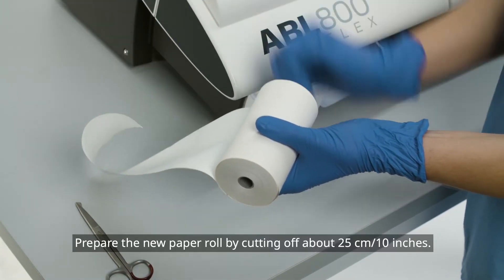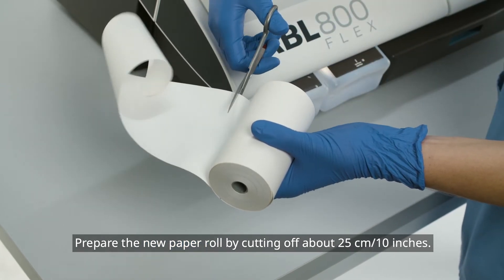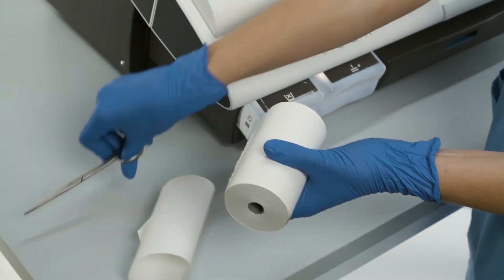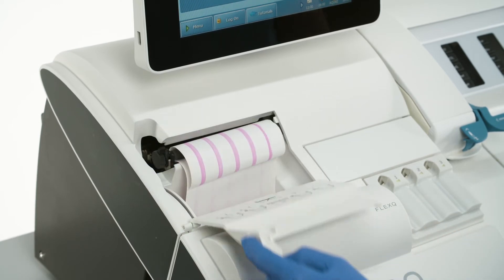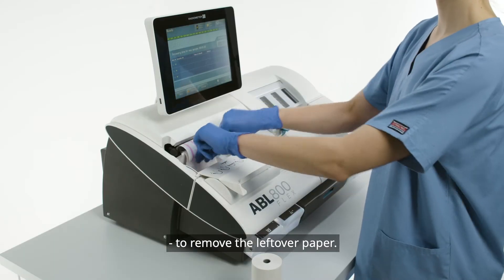Prepare the new paper roll by cutting off about 25 centimeters or 10 inches. Open the paper compartment and move the release lever fully back to remove the leftover paper.